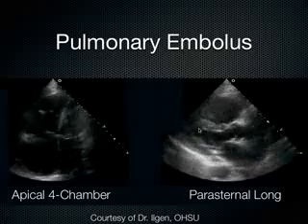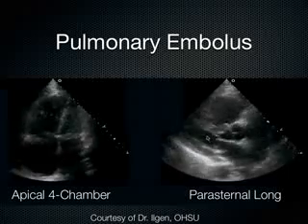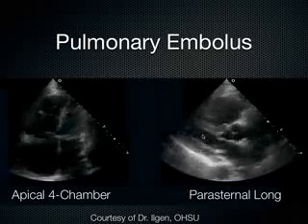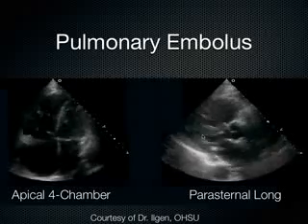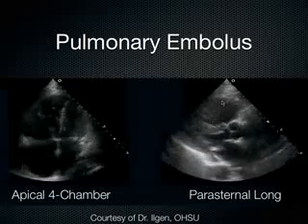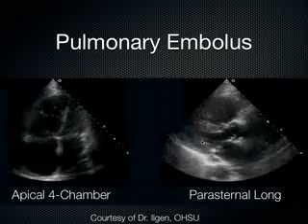The inside of the left ventricle actually comes together and makes contact. The posterior wall makes contact with the intraventricular septum. That's an empty LV. That's a hyperdynamic heart with an empty LV. That tells you that the fluid's not getting there through the lung vasculature because it's all getting stuck. The RV is trying to pump against a pulmonary embolism. The RV is very dilated here, but you can't get the blood over to the LV.